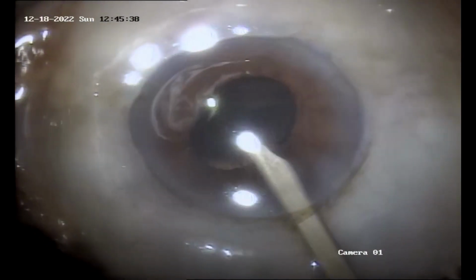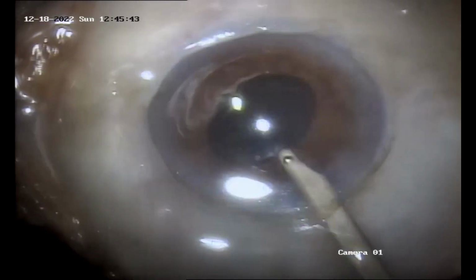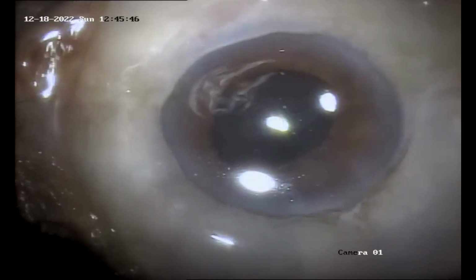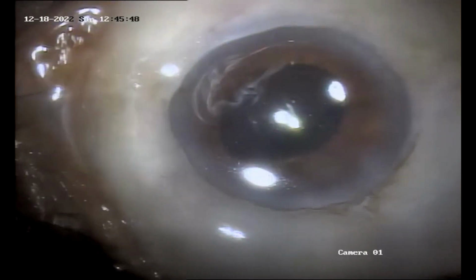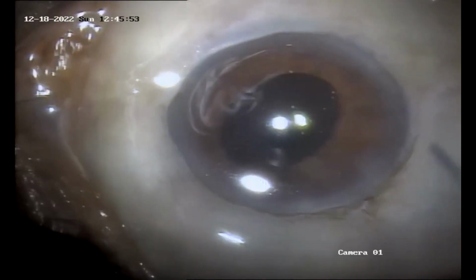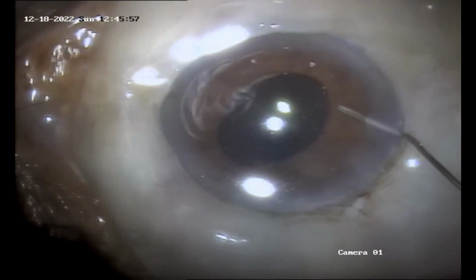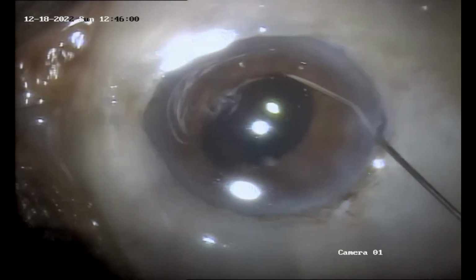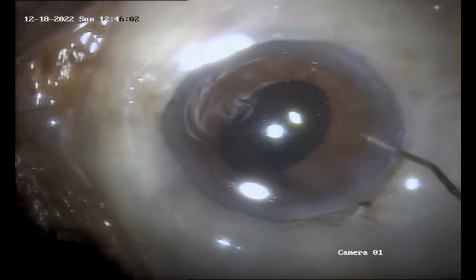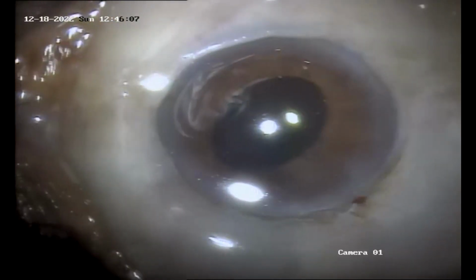Remove the cortical matter behind the lens in order to prevent the postoperative induced myopia, refractive surprise, cellular reaction, and transient rise of intraocular pressure.